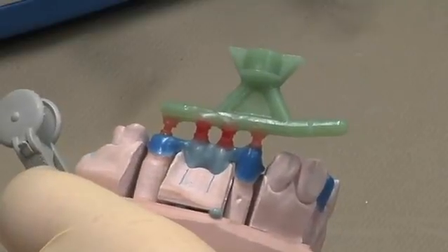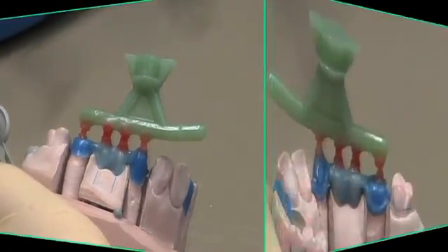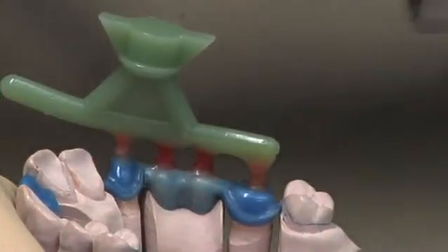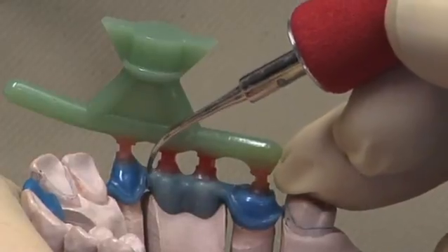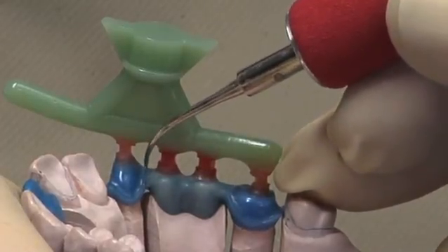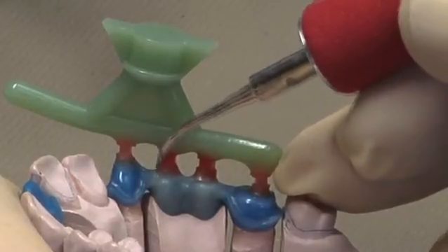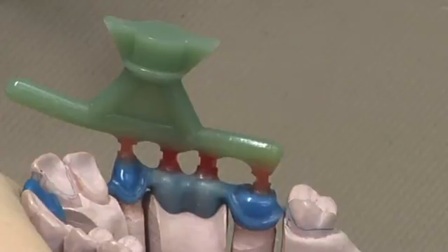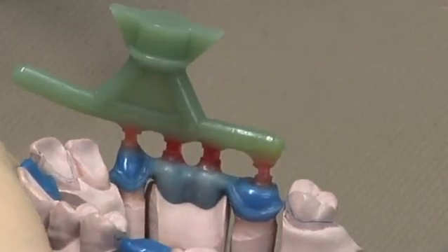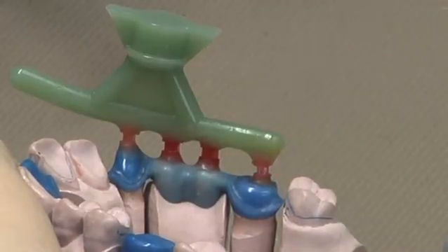Not melting the wax of either the coping or the pontic. Rotate the model around and place a small droplet just over the top of the connector to seal the little cut made by the separating filament. My pattern is now ready to be drawn from the model, placed into an investment mold, and invested for the casting process.